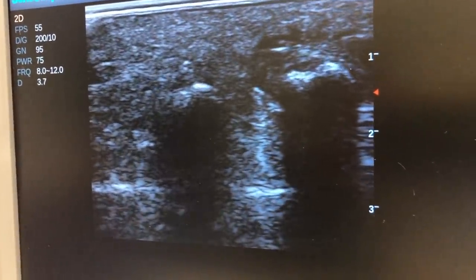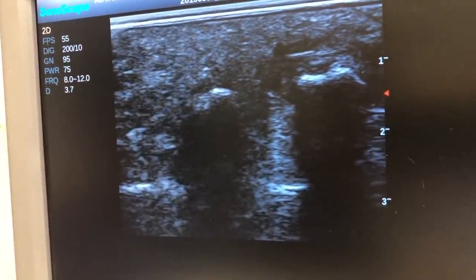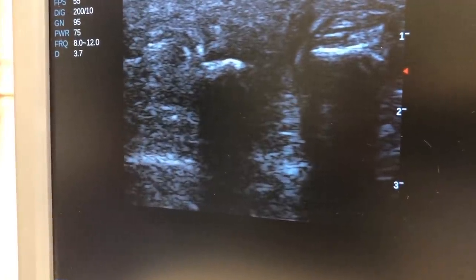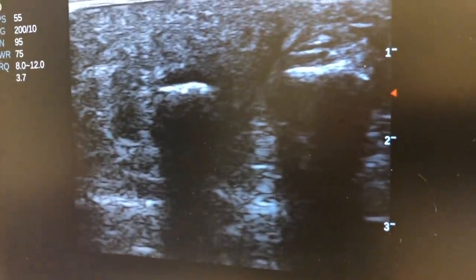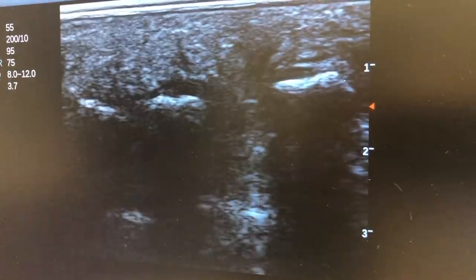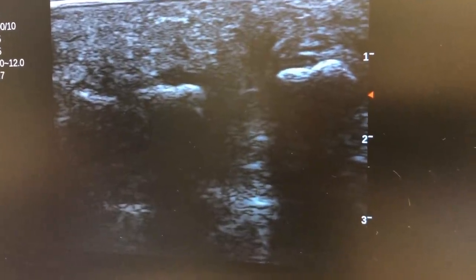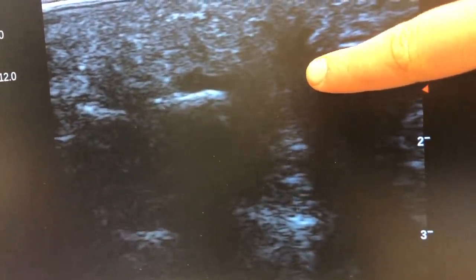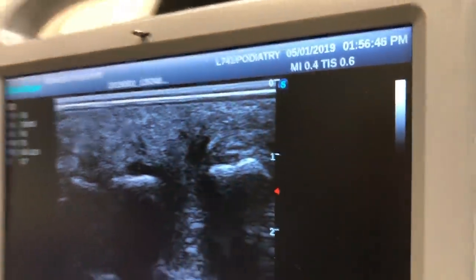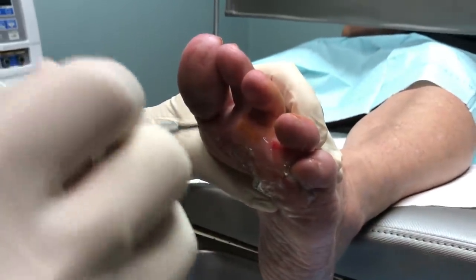We can't see it too well, so I'm trying to adjust the image. Sometimes you can actually see the vessels flickering like a heartbeat. You can kind of see the little circular thing dead center — that's kind of what we're looking for. Once we actually start the procedure, you can see a little bit better. Between the third and fourth, you can see how they're splayed out, which is from the anesthetic, but also the neuroma.